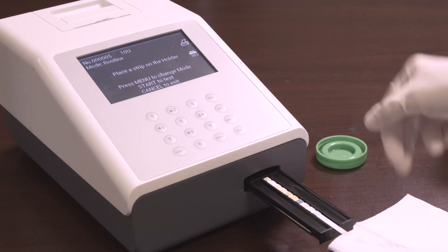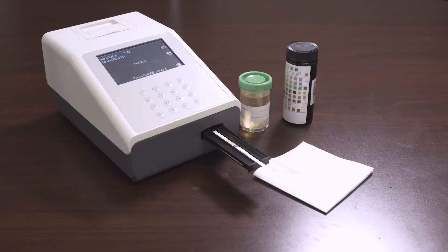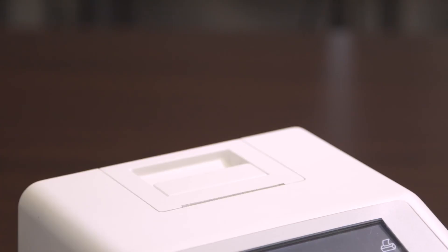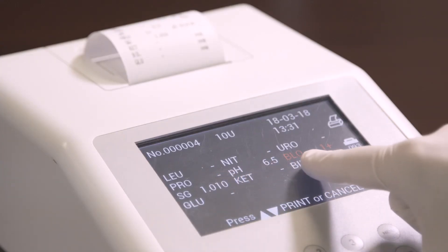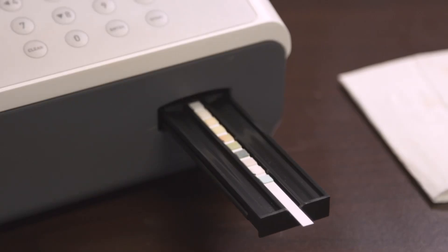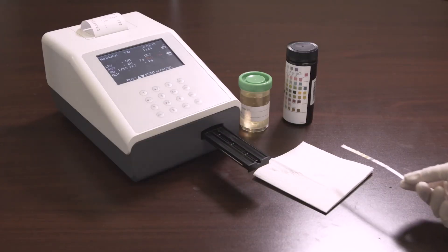Place the strip with the reagent area facing upwards onto the strip holder. When the countdown clock on the display reaches one, the strip holder will carry the strip inside the analyzer and begin testing. The results will be displayed on the screen and stored in memory after each test. If auto print is on, the results will be printed. Any abnormal results will be highlighted on the screen and flagged on the printout. Remove the used strip from the strip holder when the strip carrier moves out, and discard the used strip according to local regulations.